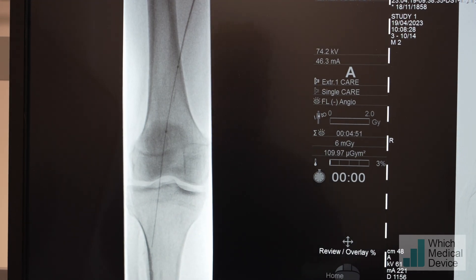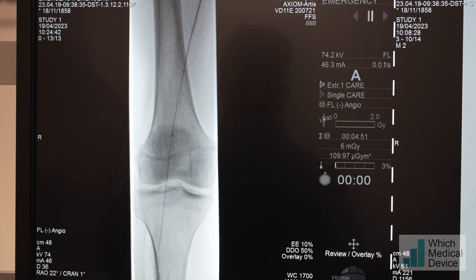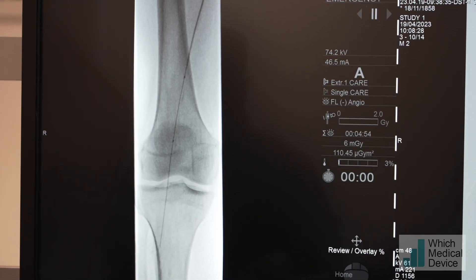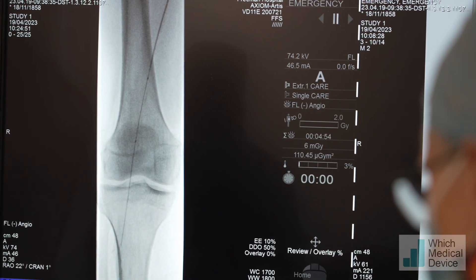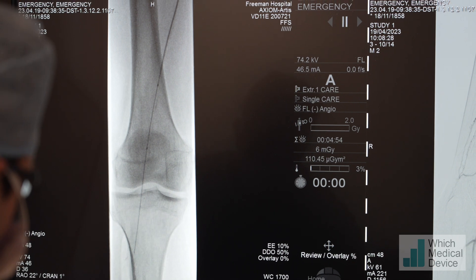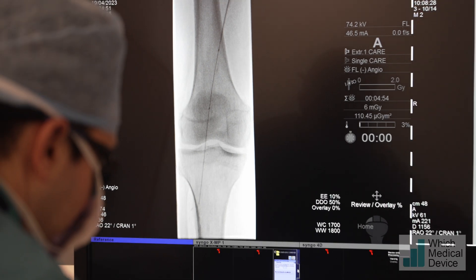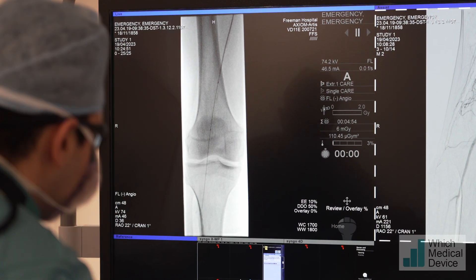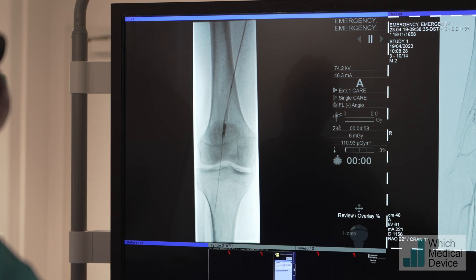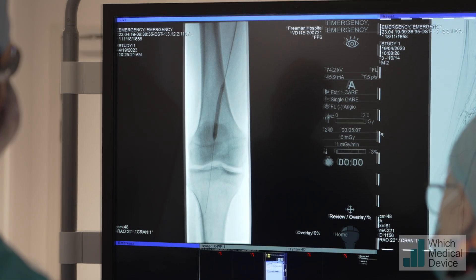You can see the cortex of the bone - the vessel is still patent. I'd take it a centimeter further in and you'll get some overlap with your next balloon inflation as you come back up. I'd inflate there until the wasting disappears - the pressure is irrelevant. You might feel a bit of pain in the leg - it shouldn't be more than two or three out of ten; if it is, let us know. A stretchy feeling coming just now. We can save that - you can see the narrowing and the waist in the balloon. That looks good.